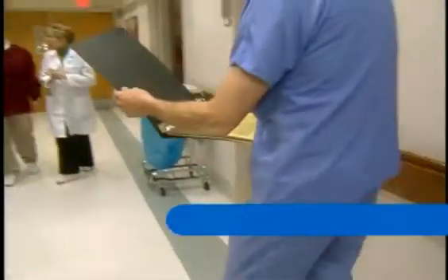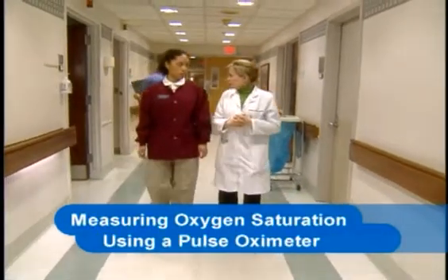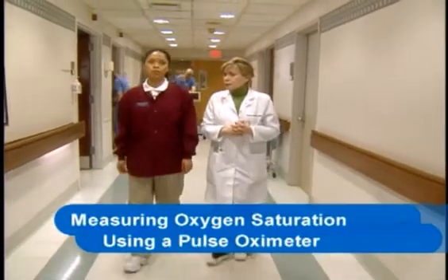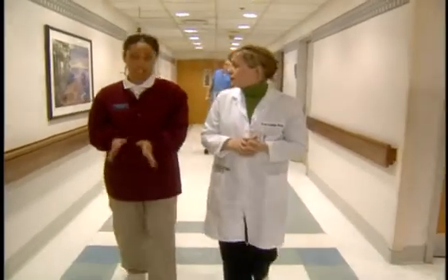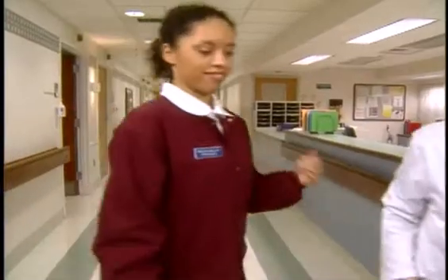Okay, so tell me about your patient. Well, we're monitoring my patient's oxygen saturation to assure he's maintaining adequate oxygenation. Does the order include parameters? Yes, it does. We're to titrate the flow rate of his oxygen to keep his saturation at or above 92%. I think that means we're to adjust the rate, right? Right, very good. And we're to call the physician if his oxygen saturation drops under 92%. Okay, let's go check his oxygen level. Okay.